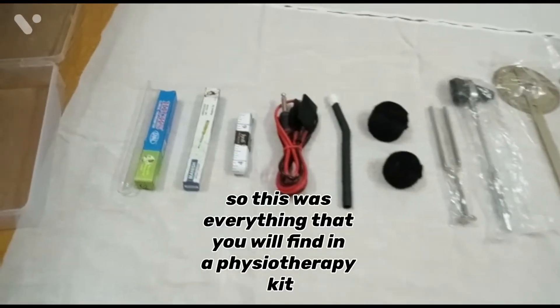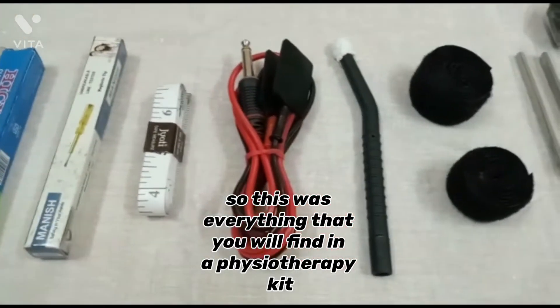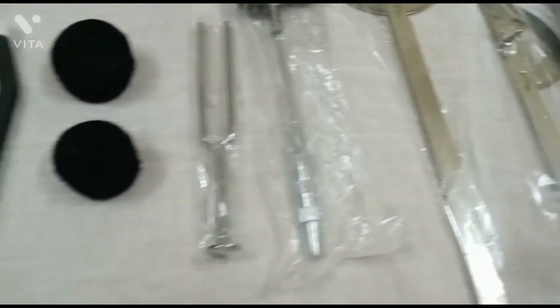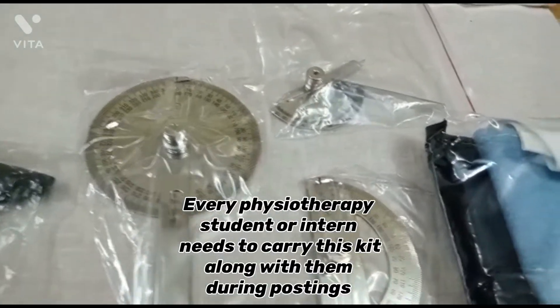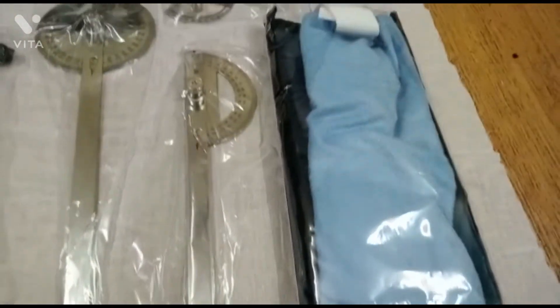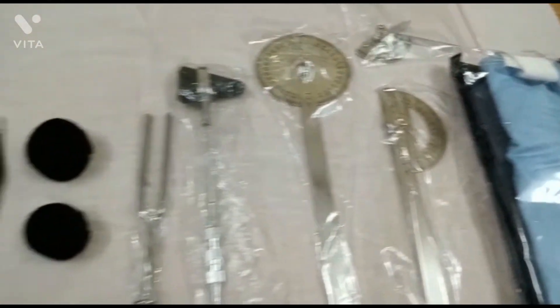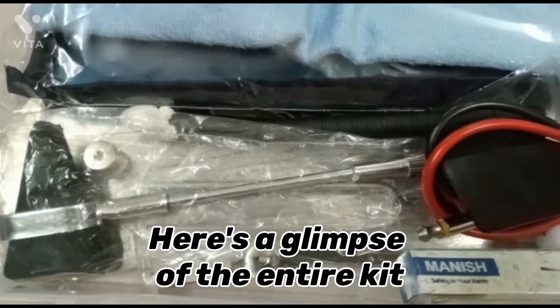So this was everything that you will find in a physiotherapy kit. Every physiotherapy student or intern needs to carry this kit along with them during posting. Here's a glimpse of the entire kit.